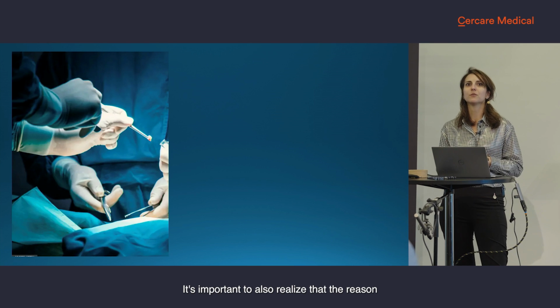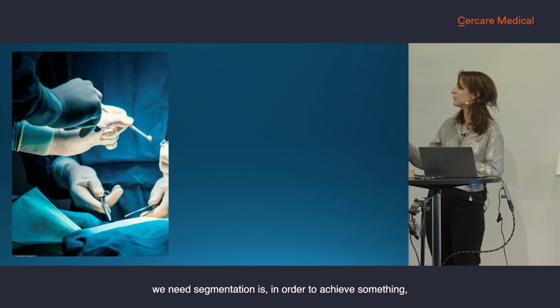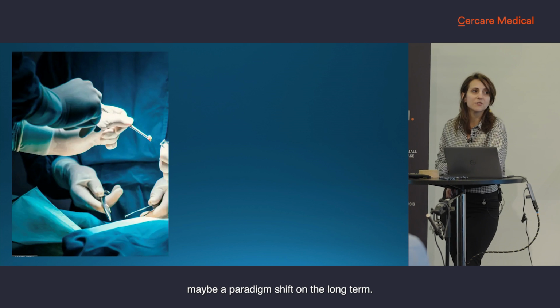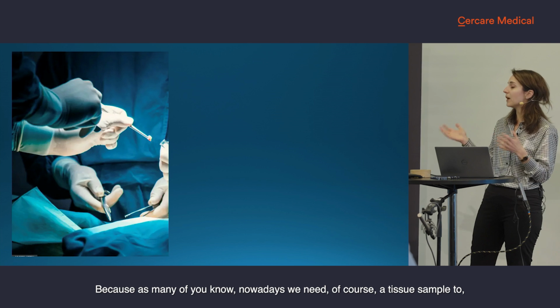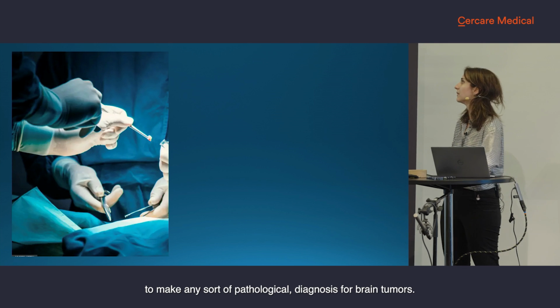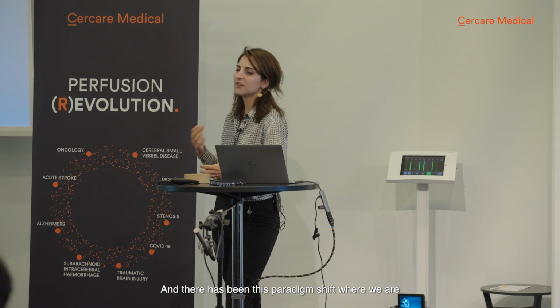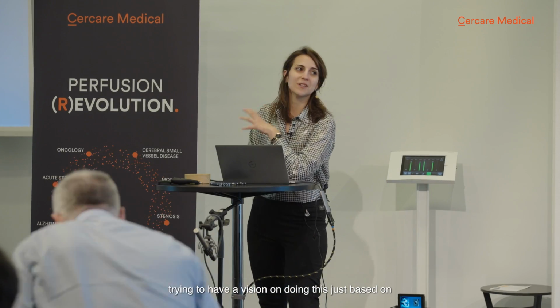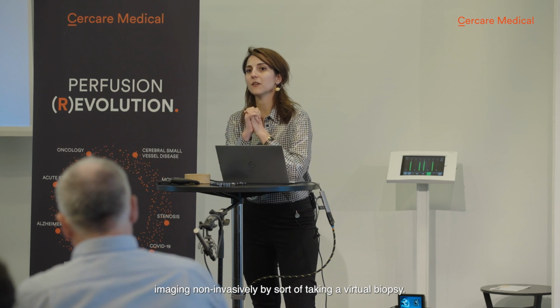It's important to also realize that the reason we need segmentation is in order to achieve, maybe, a paradigm shift in the long term, because as many of you know, nowadays we of course need a tissue sample to make any pathological diagnosis for brain tumors. And there has been this paradigm shift where we are trying to have a vision of doing this just based on imaging, non-invasively, by taking a virtual biopsy.